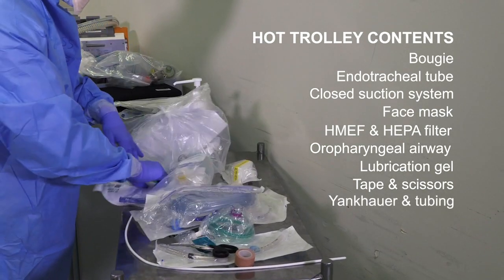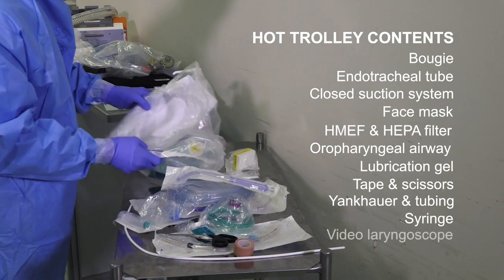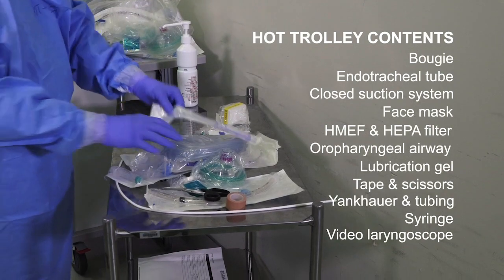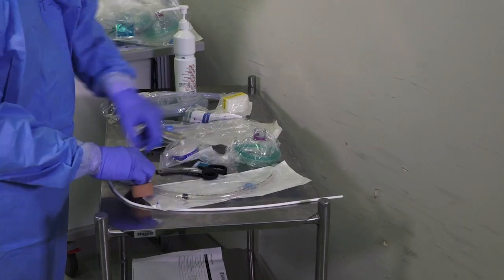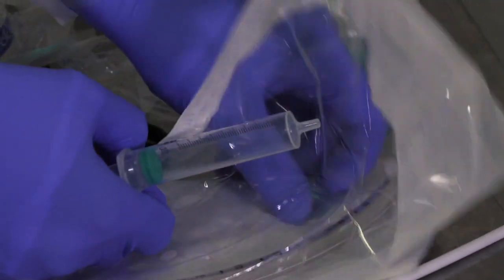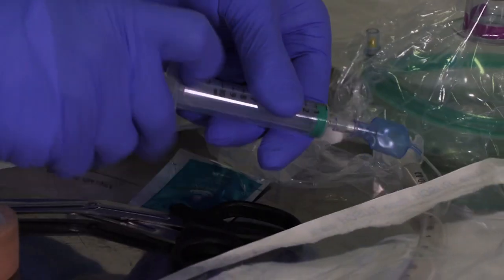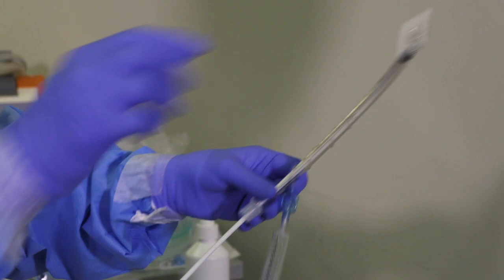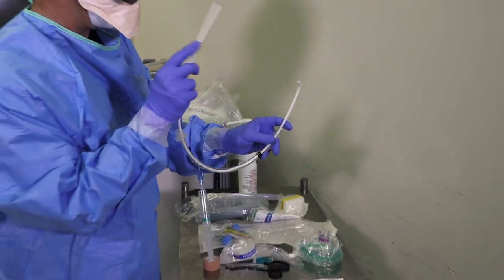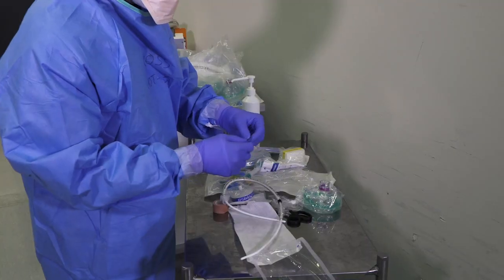A Yankauer and suction tubing on the hot trolley. A syringe to inflate the cuff on the hot trolley. While you're here, could you check the cuff of the tube? The cuff has been checked. Preload the tube with the bougie of choice — we use the D-grip — and lubricate your tube.